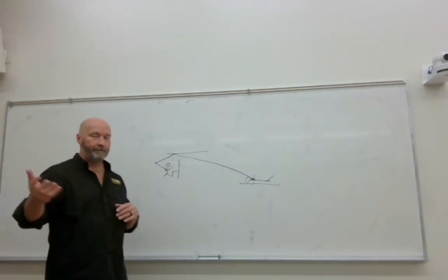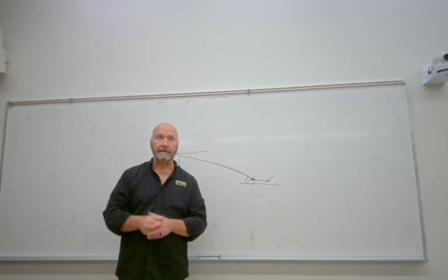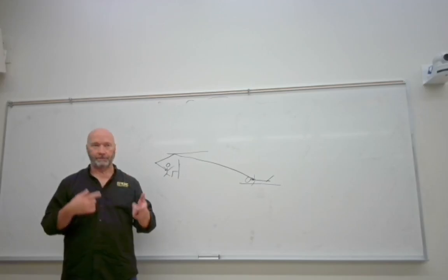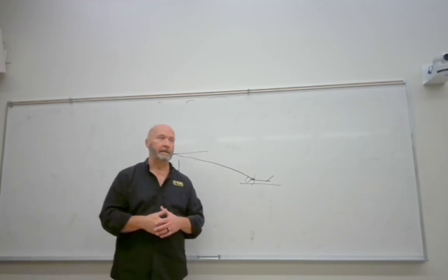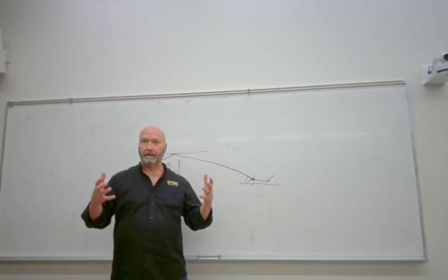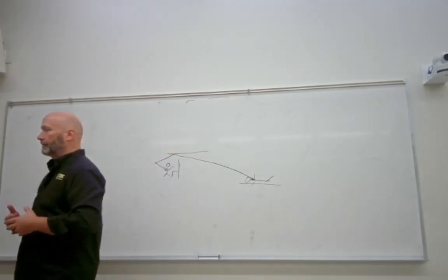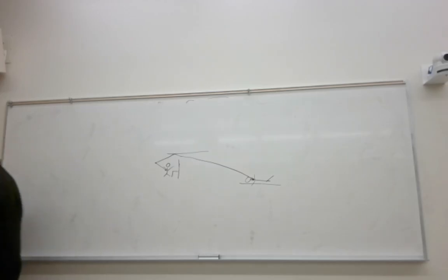If you go into our lab, I think I mentioned this the other day. You look in that back right corner, you can see it. Some places that have the room to store it, if they have a lot of ceiling space, it can be up at a false ceiling. Some of your low energy, lower output, it might actually be in the control tower, which again is just adding weight to it, because you got a lot of stuff in there that we're going to talk about as we go on.